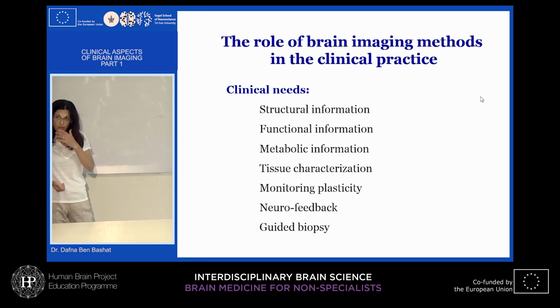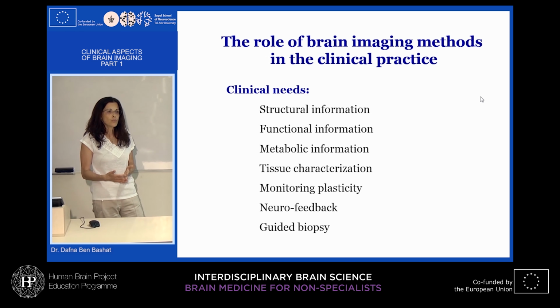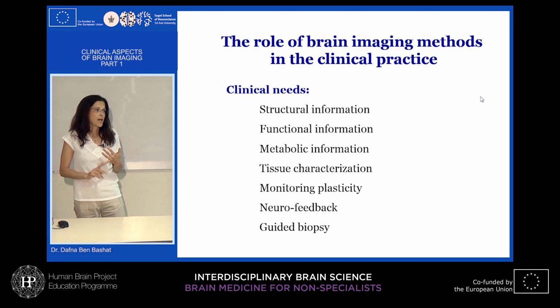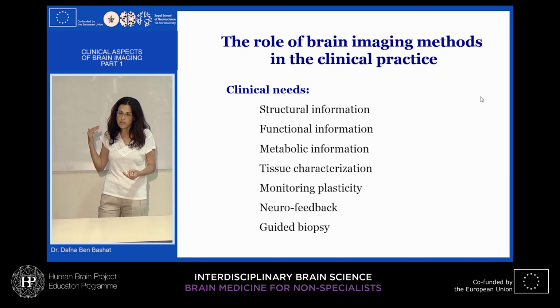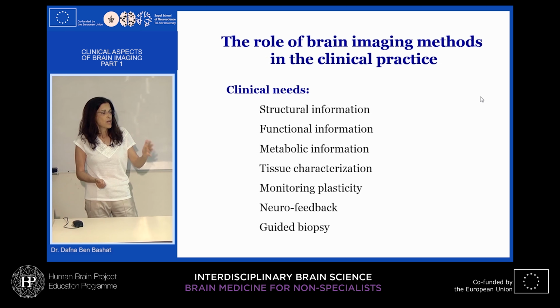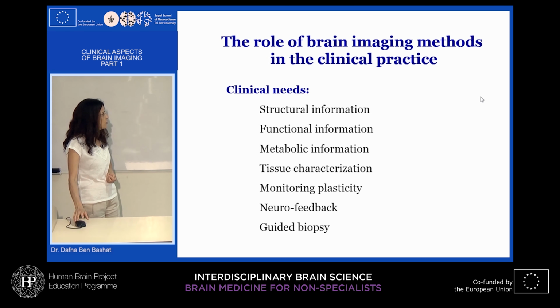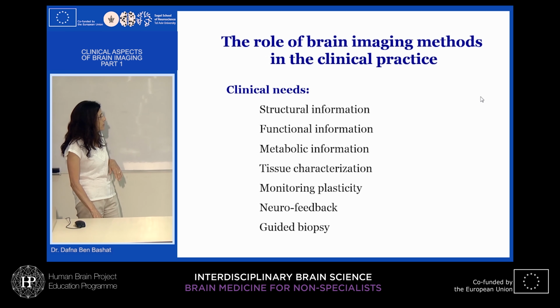And many uses of imaging modalities are in guided biopsy, because if we want to take a sample from a tissue, we want to know where we're taking it. And a lot of the devices now that are coming are always with guidance. So we know ultrasound guides a lot of biopsies, MRI guides a lot of biopsies, and there are a lot of device combinations. We talk about PET MRI now. We heard just a couple of weeks ago that they now also do radiation guided with MRI. So there is a lot of improvement and research in development of new hybrid devices of imaging and therapeutic devices.